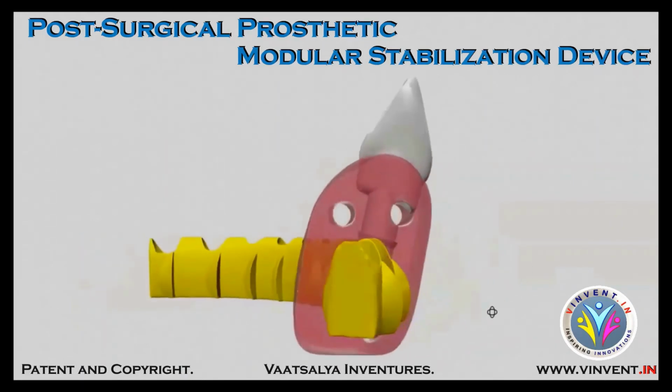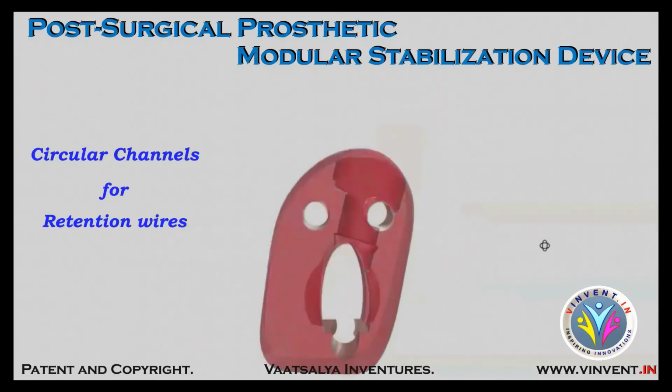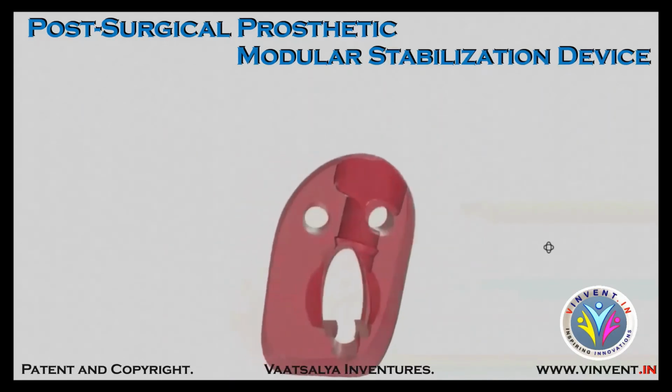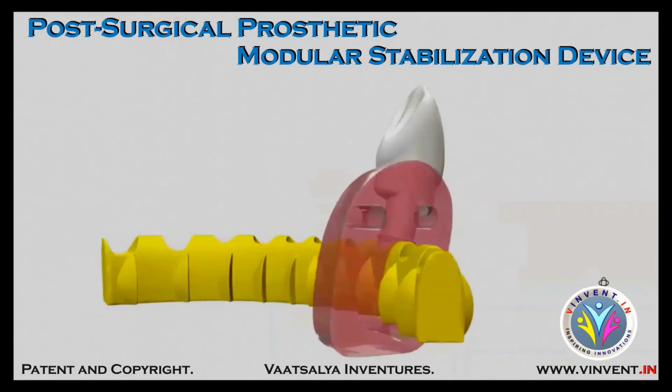The soft tissue component has space in the center which is shaped to incorporate the internal spine, and it also has 3 circular channels to allow for retention wires. Each of these three channels and the channel for internal spine pass through and through at the core of soft tissue component. On the top surface of soft tissue component, there is space to allow for tooth component to seat and engage with the internal spine.